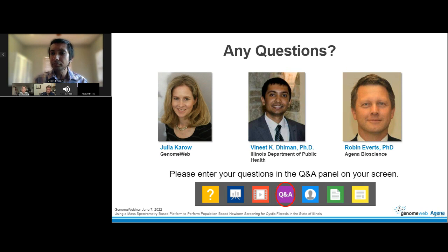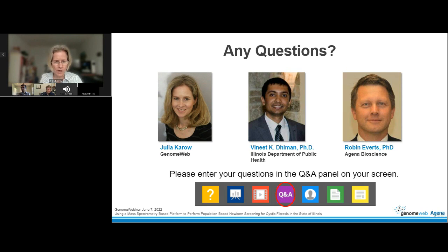Okay. Here's maybe a question for Dr. Everts. So why did Agena decide to go beyond the ACOG recommended 23 mutations, which are supposed to get you 80 to 90% of the cases? What's the reason behind that?